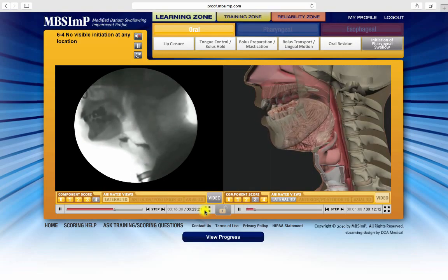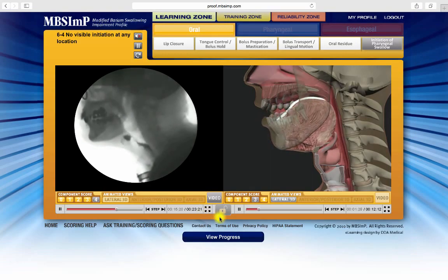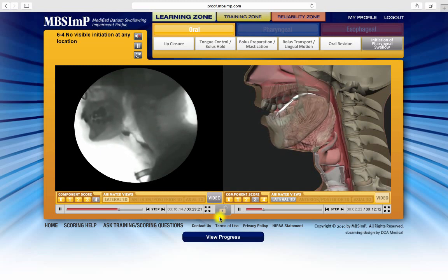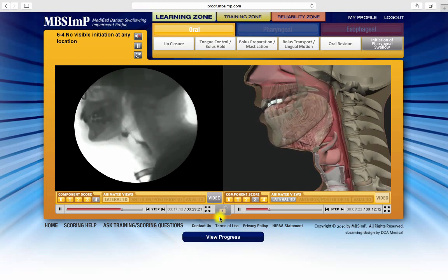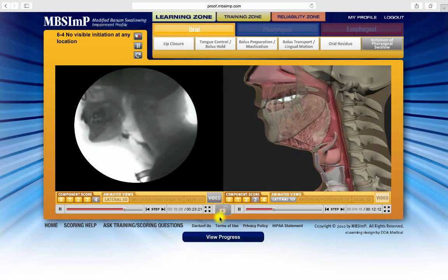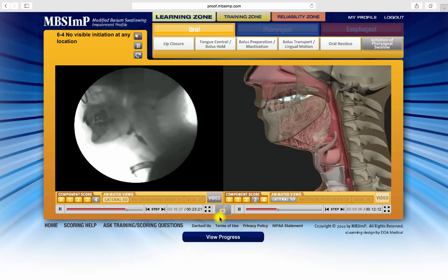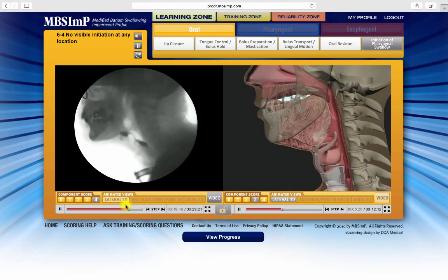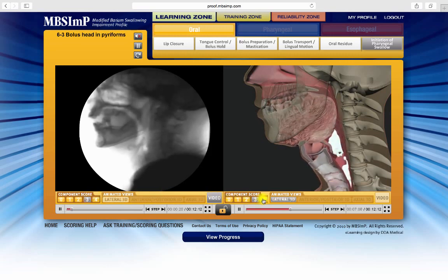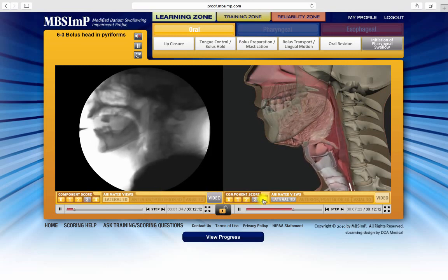The independent control of the media windows allows two different scores to be viewed and compared using either the fluoroscopy example or the animation. Select the scores to be compared, and place one in the left window and one in the right.